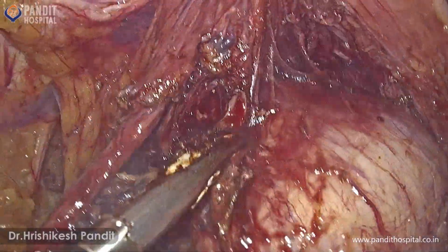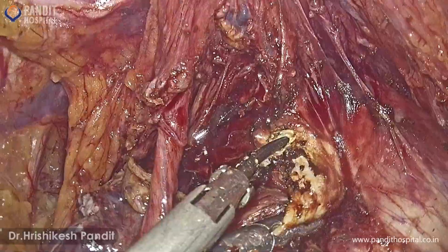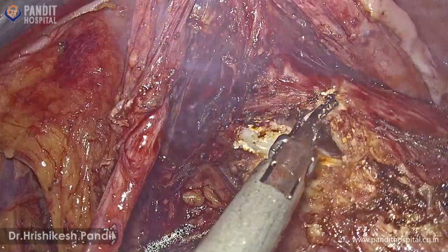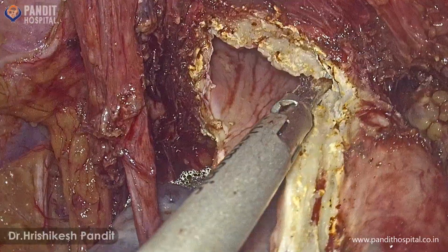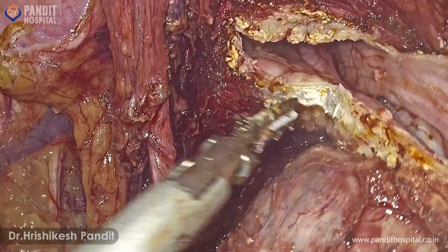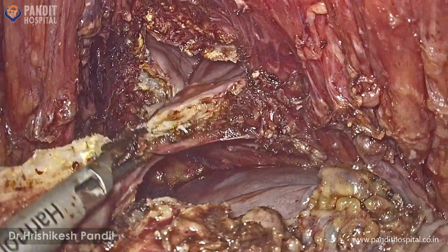After adequate parametrectomy, next step is opening of vault. At least up to 2 cm of vagina is to be excised for adequate tumor-free margin of specimen. After the vault is opened, specimen is removed vaginally.